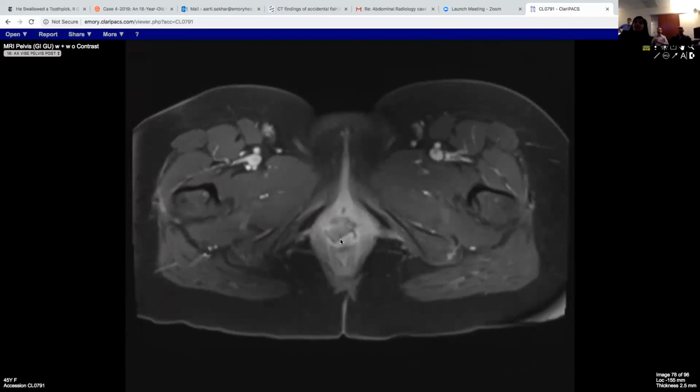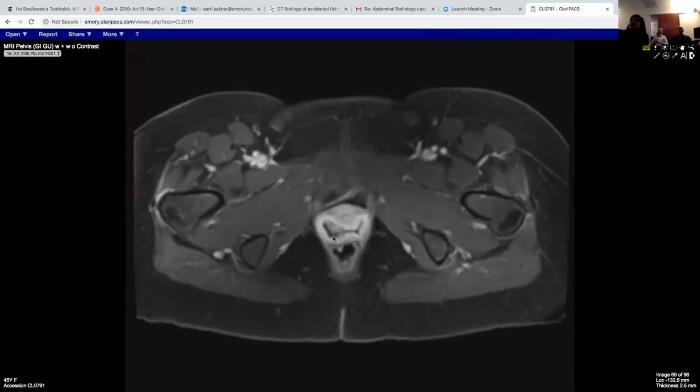Yeah, so you can often have mixed as well. Some parts can be melanotic and some parts can be amelanotic. And so this part was not T1 hyperintense, and it had a little bit more T2 hyperintense signal. So this part was more of an amelanotic melanoma. Yeah, and I think this part they were thinking was more hemorrhage. The T1 hyperintense area certainly could have had a little bit of a melanotic component as well. It's hard to completely differentiate.